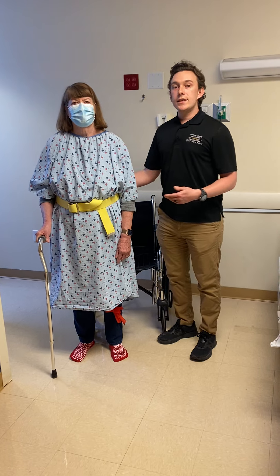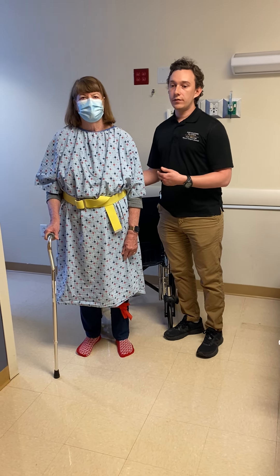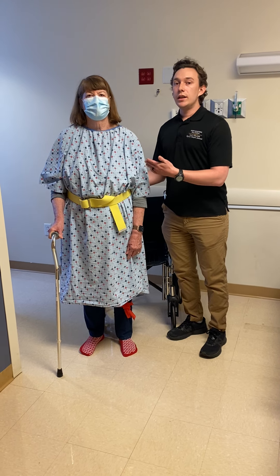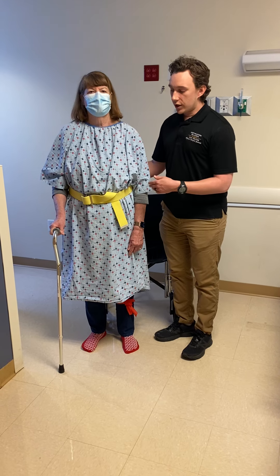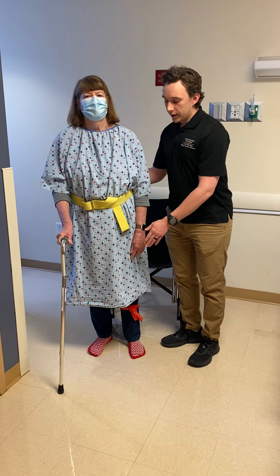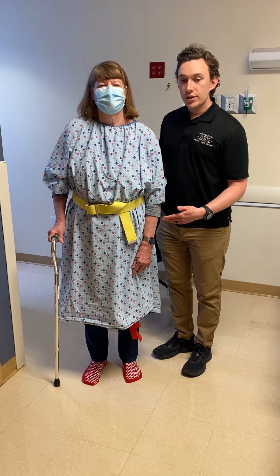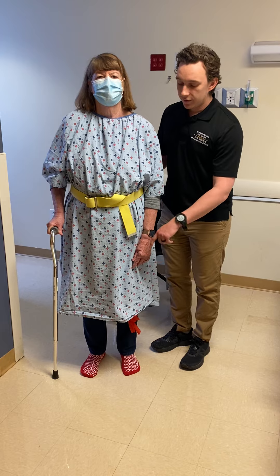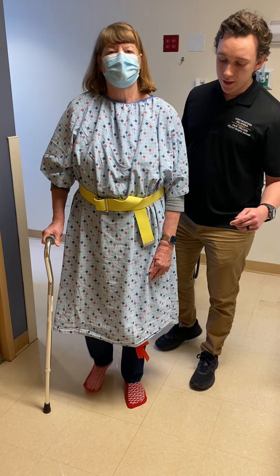As nursing or therapy staff, I want to make sure to position myself on the patient's bad side, as they often need more help and stability on this side. I'm going to instruct my patient to bring the cane forward, then the left leg, then the right leg. As that person gets more fluid, they can bring the cane and their left leg forward together at the same time, and then step through with that right leg.